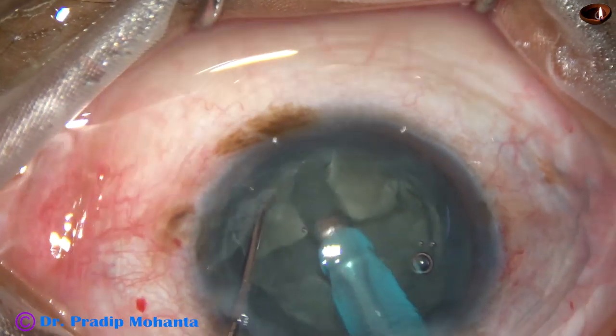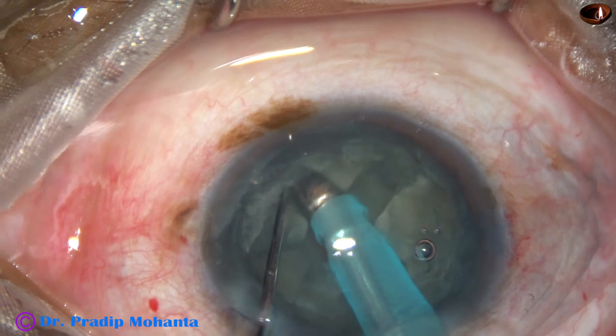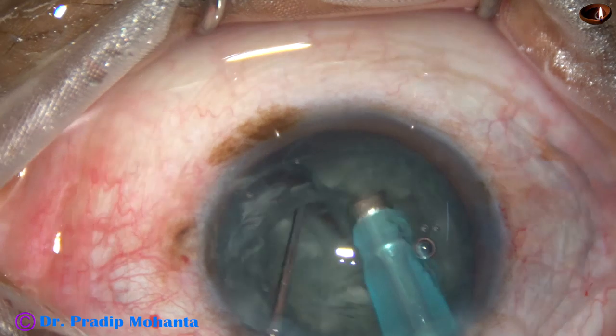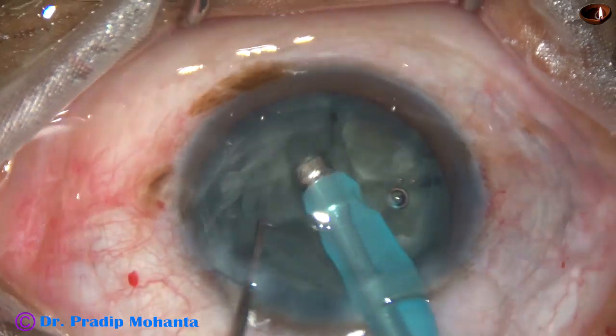And now I have to deepen these trenches to about 80% depth. And then I try dividing the nucleus into four fragments by opposing forces.